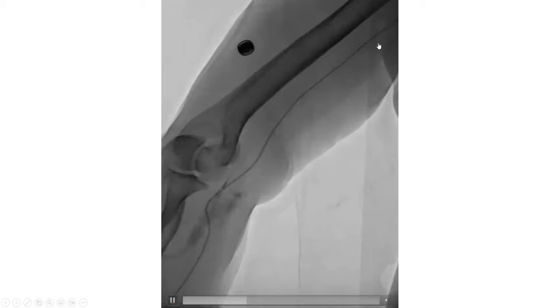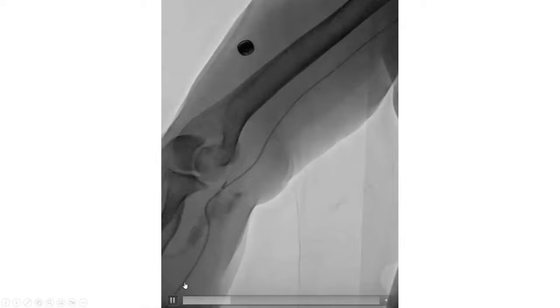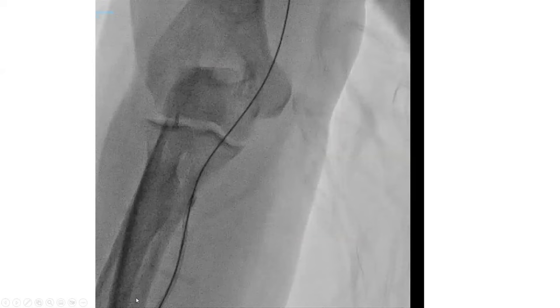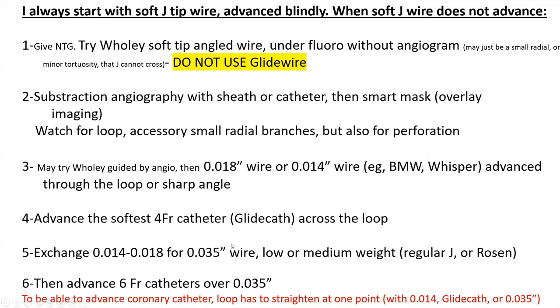After advancing the glide cath and the BMW deep up into the arm, almost to the axilla, we remove the O14-inch and we exchange for an O35-inch medium support wire, such as a J-wire or a Rosen wire. After doing this, we advance our coronary catheters. Here we tried to advance an AL1 guiding catheter — it did not go over the O35-inch wire. So we ended up advancing an Ikari left guiding catheter, which is a more slippery and dimpled guiding catheter. There are other techniques to advance that AL1 if absolutely needed, which I will explain later.